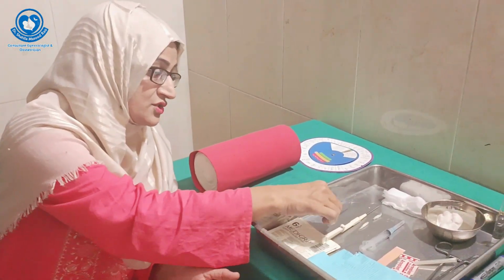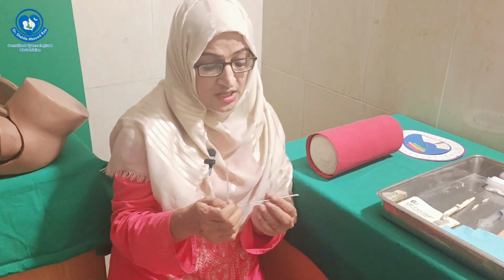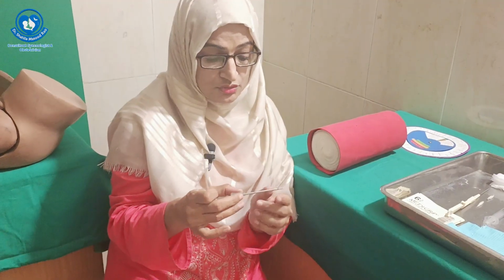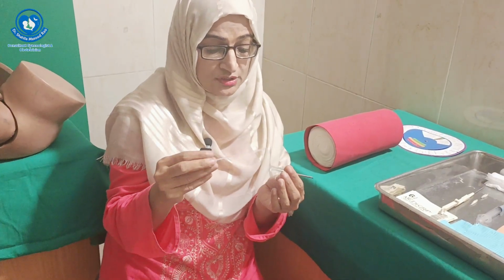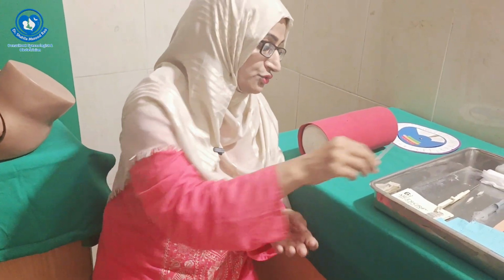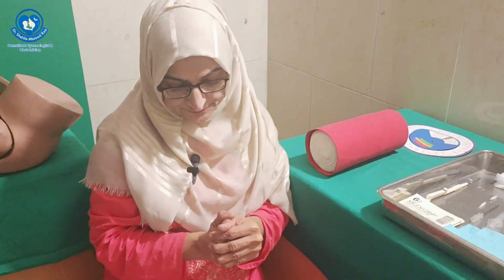The second one is the Jadelle. In Jadelle, you can see there is a trocar and a plunger. In the trocar, here is a sharp edge and here is the handle. There are two marks over there, one near the handle and one near the sharp edge, and this is the plunger. This is the plunger to insert the rod inside the arm under the skin, in the subcutaneous tissue. So these are the two which are most commonly used nowadays.